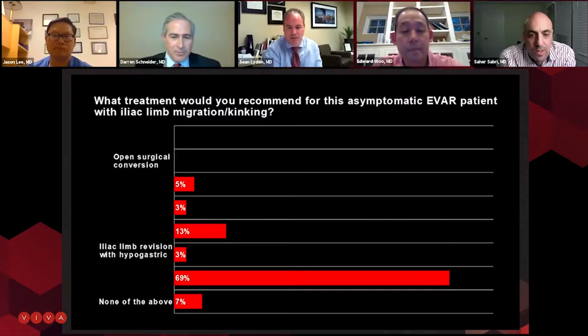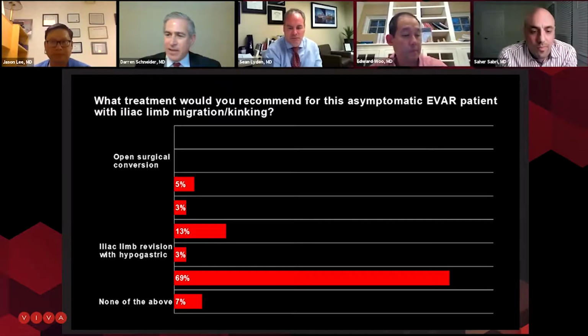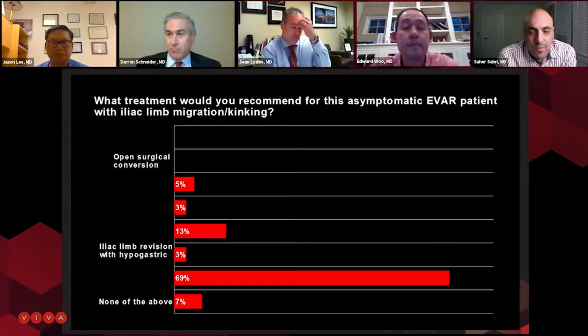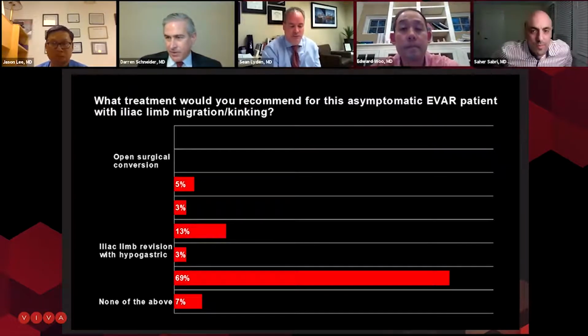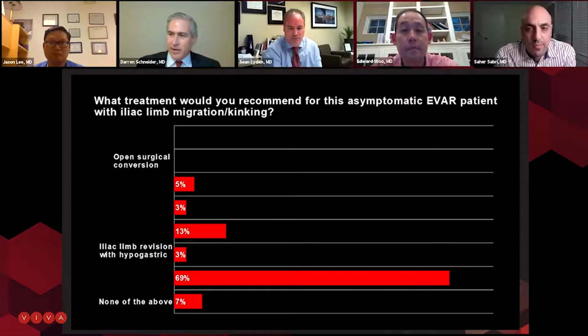Yeah, and so it looks like a lot of people want to do revision with an iliac branch device, but I think you're spot on, Ed. This is a guy who's not that old. He's 65 years old. Probably could have had an open repair even initially. And he's likely to live a long time, right? 10, 20 years. And so clearly this hasn't been durable in a year and a half or 2 years. They haven't treated all his aneurysmal disease. And so he needs a solution that's going to provide him some durability.